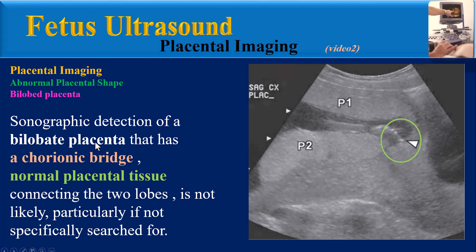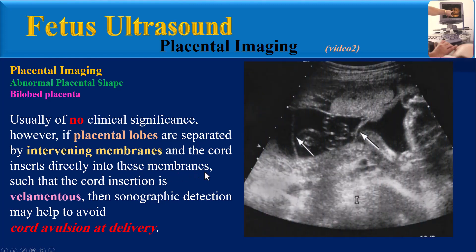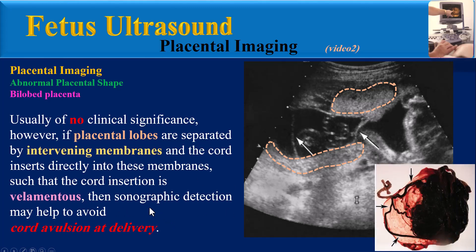Sonographic detection of a bi-lobed placenta with a chorionic bridge — that is, normal placental tissue connecting the two lobes — is not likely, particularly if not specifically searched for. This ultrasound image shows a bi-lobed placenta; the two lobes are separated by a thin bridge of placental tissue that covers the internal os. In this case the umbilical cord inserts into the bridge of tissue. A bi-lobed placenta is usually of no clinical significance.